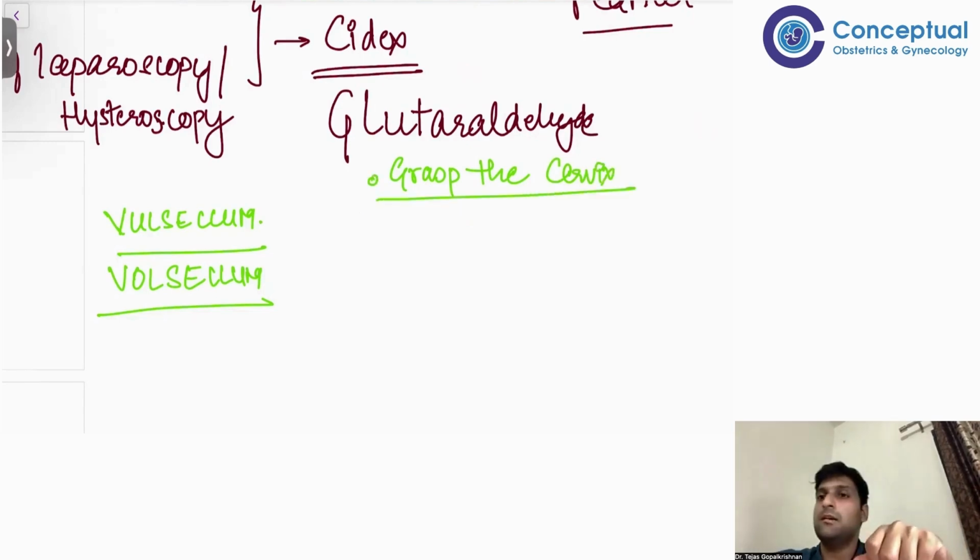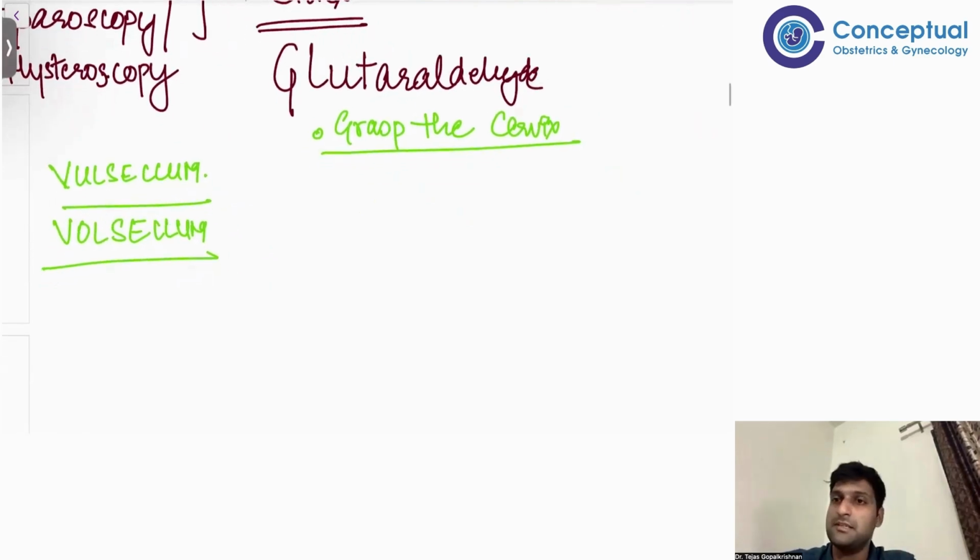Okay. After grasping the cervix, what do you do with it? Why are we grasping the cervix? What do you want to do after grasping the cervix? What can you do in the OPD? After grasping the cervix, I can pull the cervix down. I can assess pelvic organ prolapse.